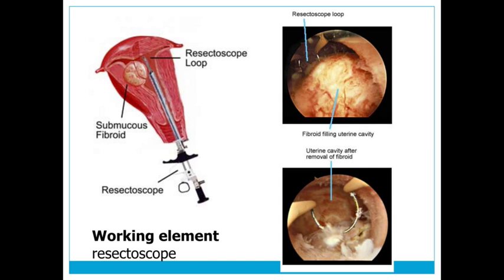An intrauterine resectoscope is used to remove polyps, submucosal leiomyomas, and uterine adhesions. It can also be used to ablate the endometrium and treat abnormal uterine bleeding. The resectoscope contains 0 or 12° scopes that are inserted into a separate sheath. A spring-loaded mechanism in the handle retracts and exposes the electrode tip. The loop-shaped electrode shaves and coagulates when activated.